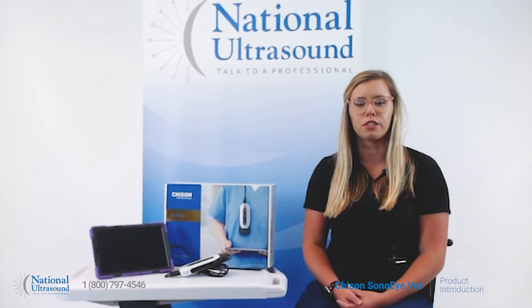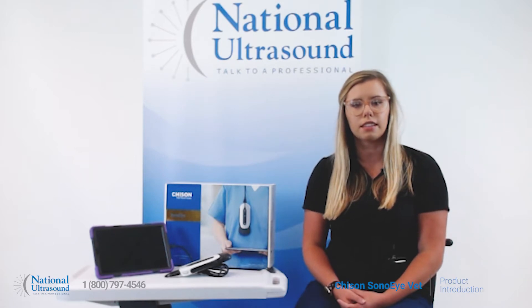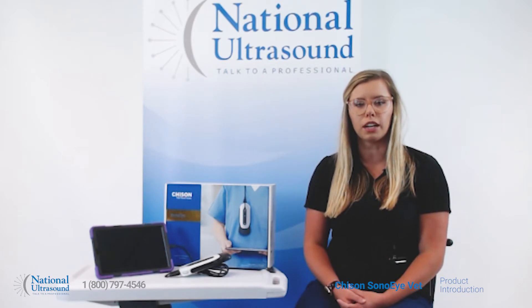My name is Kara and I'm a registered cardiac sonographer with five years of experience. Let's take a look at the new Chison Sono Eye Veterinary Ultrasound Probes. The Chison Sono Eye Vet Probes paired with a tablet become a complete handheld ultrasound system, great for initial diagnosis and veterinary point of care settings.